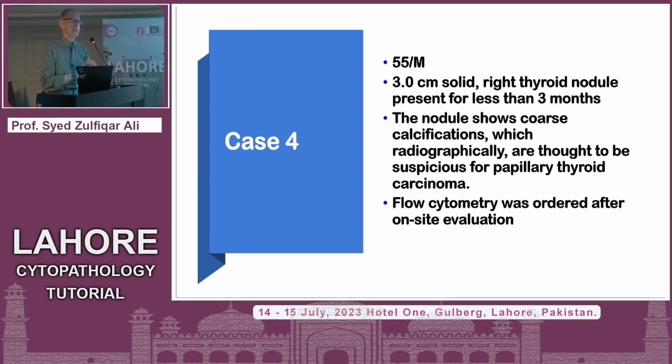For some reason, when I did the on-site evaluation, I sent it for flow cytometry. To be most honest, right here, maybe I made a mistake, maybe I did not, but I just wanted to give you that information. It's an $800 investigation, so I just wanted to tell you that we shouldn't be casually doing flow cytometry on every case.